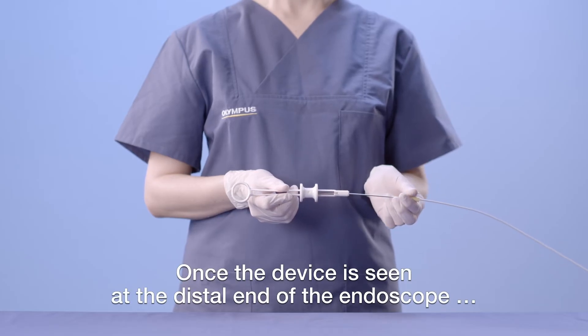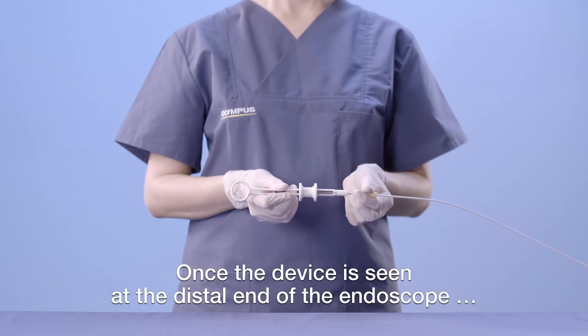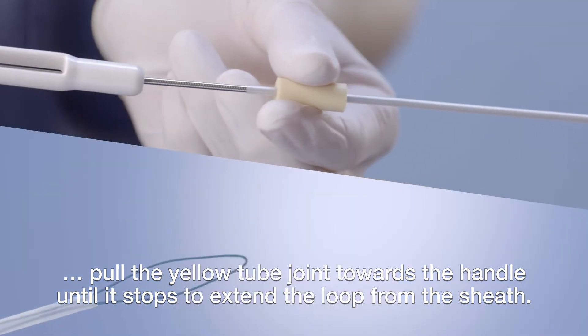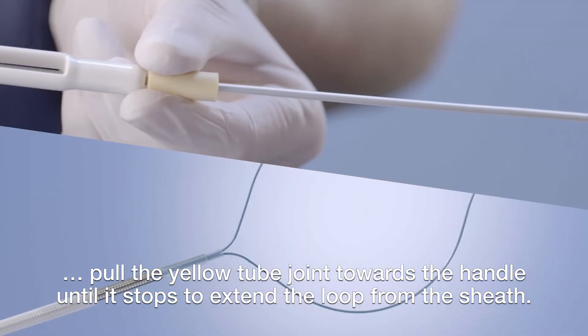Once the device is seen at the distal end of the endoscope, pull the yellow tube joint towards the handle until it stops to extend the loop from the sheath.